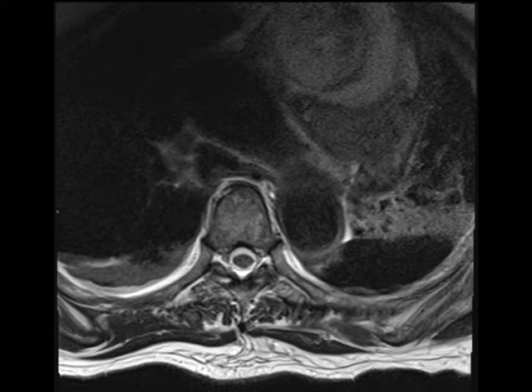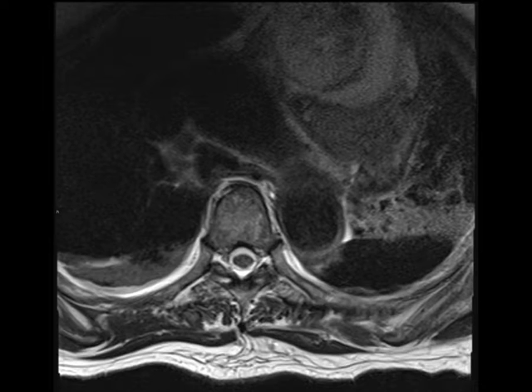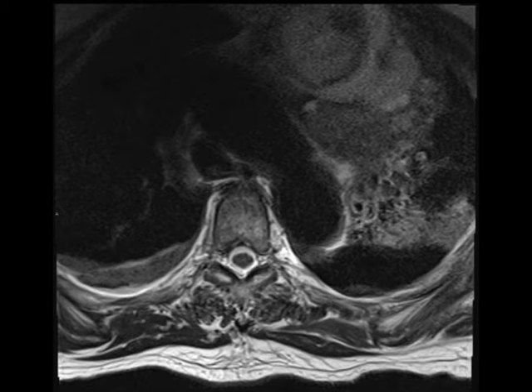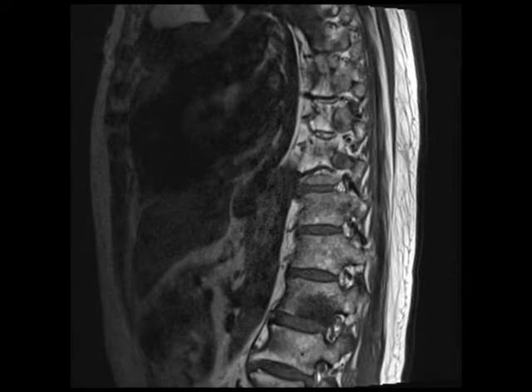Older female with a history of low back pain. An MRI of the thoracic and lumbar spine was obtained, partially demonstrating a solid and cystic appearing, partially circumscribed anterior mediastinal mass, with components that are both T2 hyper and hypo intense, as well as T1 hyper and hypo intense. The fat-saturated post-contrast images demonstrate a rind of enhancing tissue with a more solid enhancing mural component at the lesion's inferior most aspect.